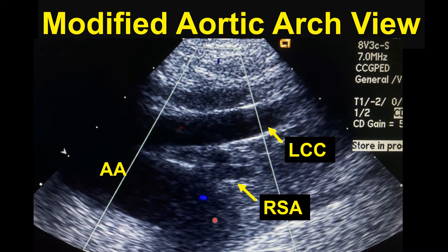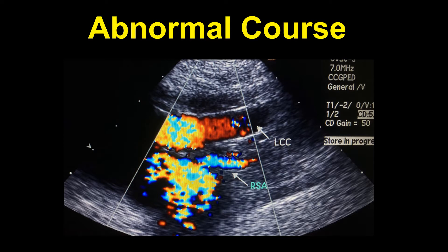We're looking at a modified aortic arch view. I've tilted the probe to show the longest segment possible of the left common carotid. Here is our right subclavian artery coming off the aortic arch and again the left common carotid. Color Doppler helps to identify this artery a little bit better — left common carotid and here is our right subclavian artery as it goes on to wrap around the esophagus.